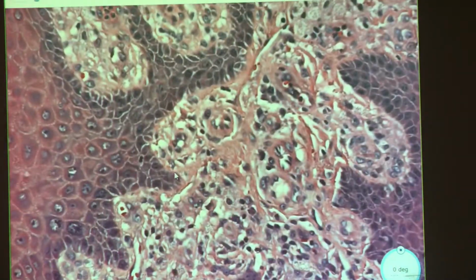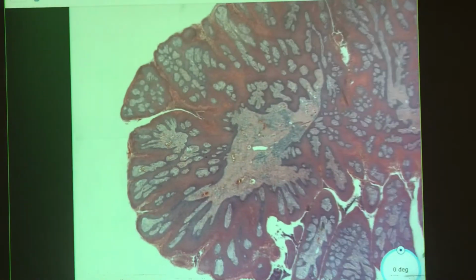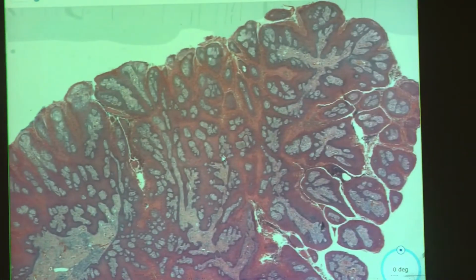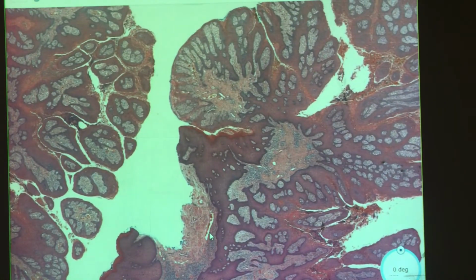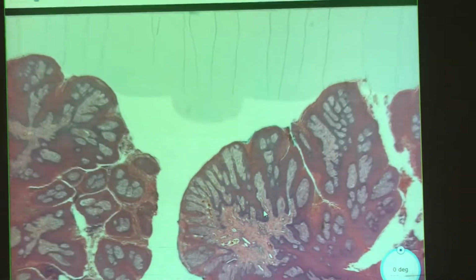So, okay, this is derm, so we do have to talk a little bit about epidermis, right? And it's kind of difficult to appreciate in this because it is rather tangential. But okay, so you notice the acanthosis, which is very good. What do you think about the dermal papillae and the rete ridges? Do those look normal? They seem elongated. Okay, good. I think this is way too much for it to be like tangential.